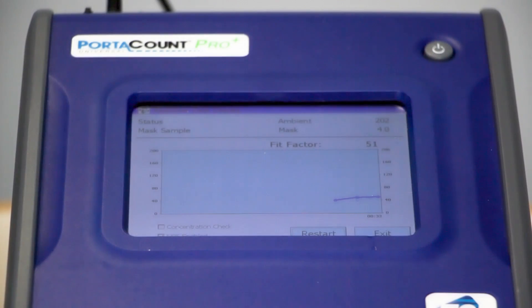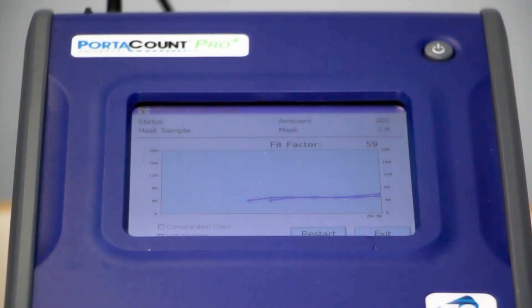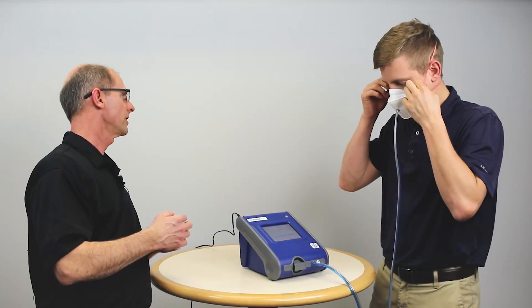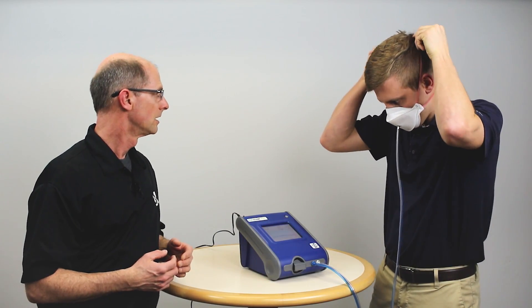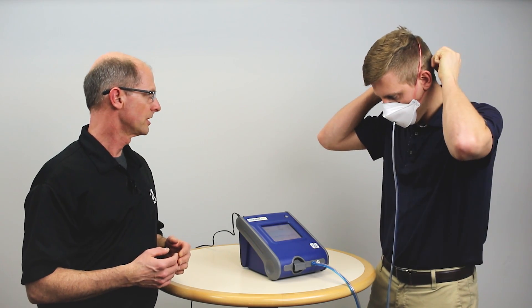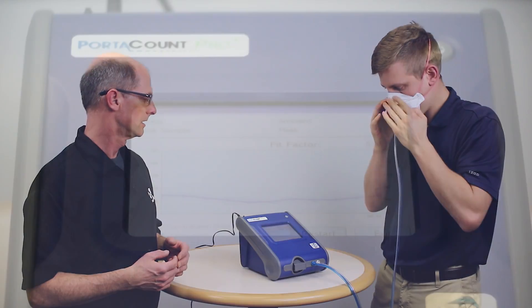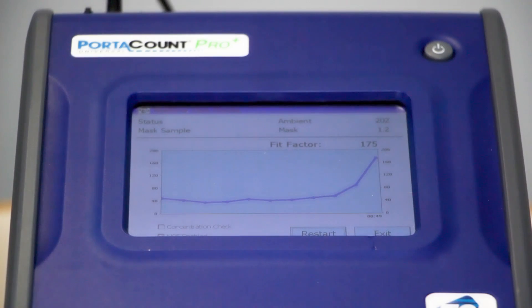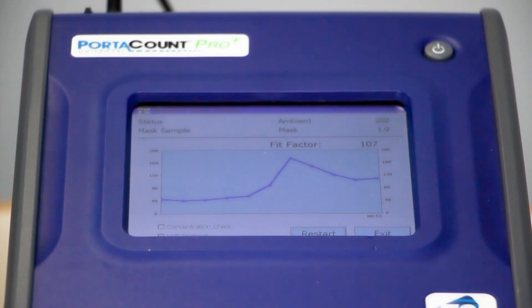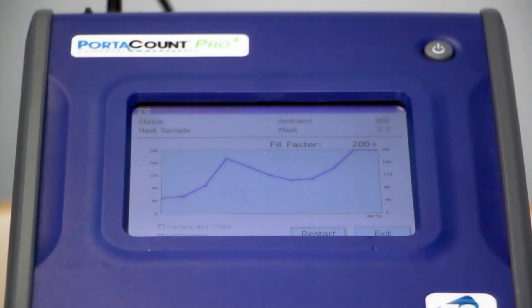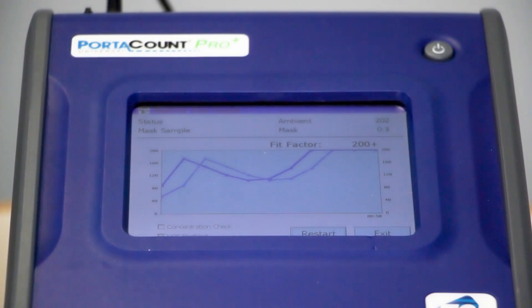We have a line starting out at a fit factor of 50, so we know we're not achieving our 100. As he continues to make adjustments — moving the strap up higher on his head and smoothing it out over his nose a little bit better — that number jumps way up above 100 and we're maxed out at 200 plus. He just found a way to make that mask fit properly.